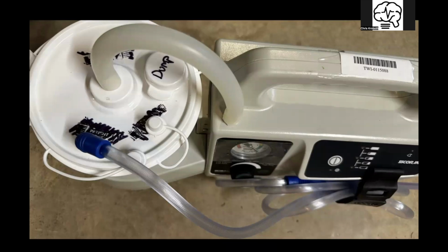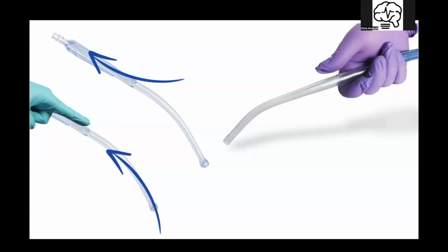This will make or break people. I have seen more often than not people not pay attention to the suction canister lid labeling, and have this to the patient to the vacuum port, and not able to get any suction. This will make or break you. I highly recommend taking a magic marker and just writing over where the actual labeling is so you can easily see it at 2 in the morning.